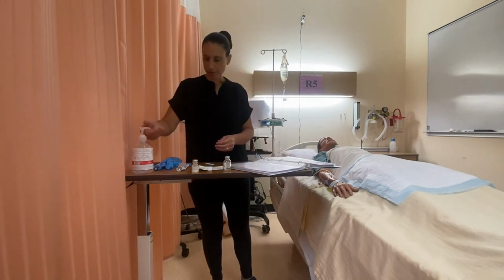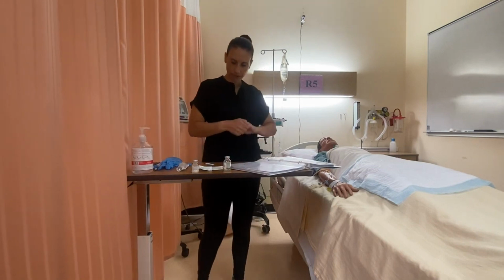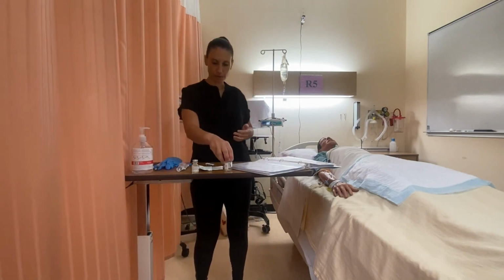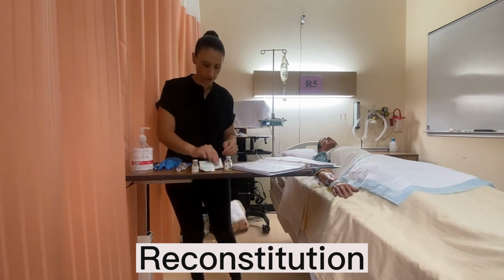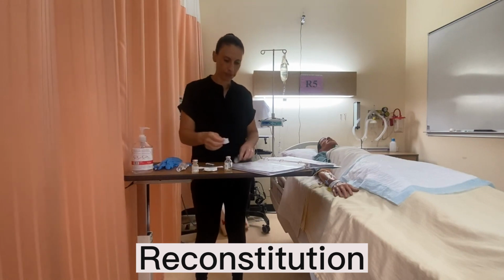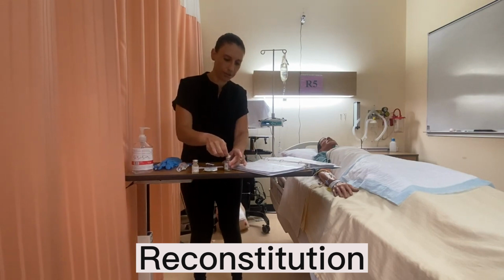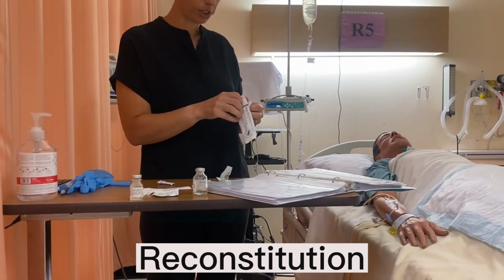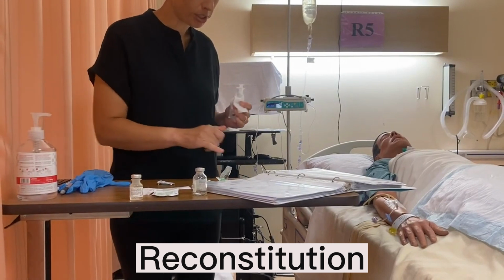All right. So I'll do my hand hygiene. Okay, I did my first check. I compared it to my PDM as I pulled it out of the Pyxis. Okay, and I'm going to swab the top. 30 seconds, dry for 15. And I'm going to banana peel my syringe. And I'm picking an appropriate size syringe.